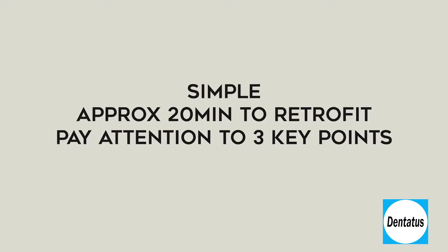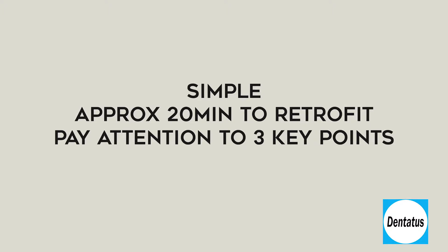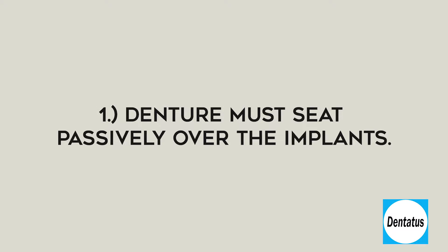The Denture Comfort technique is simple and with some practice, it will take approximately 20 minutes to retrofit the denture. To ensure success, it's important to pay particular attention to three key points. First, the denture must seat passively over the implants. If there's any interference, this can cause prosthetic overload and lead to implant failure.